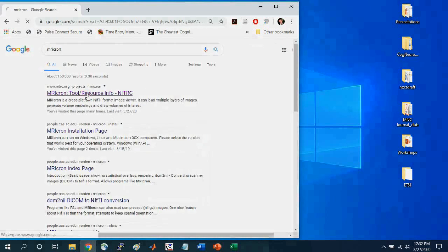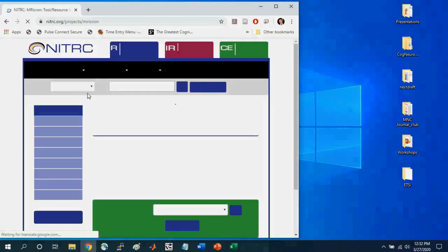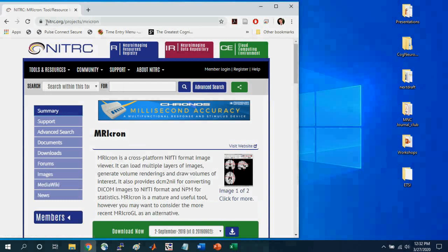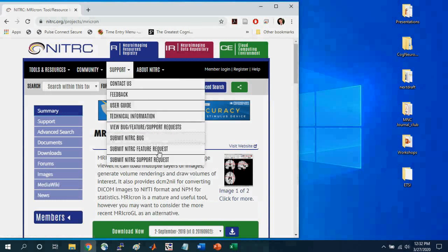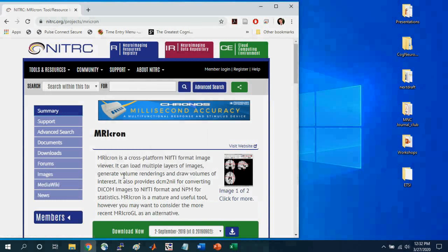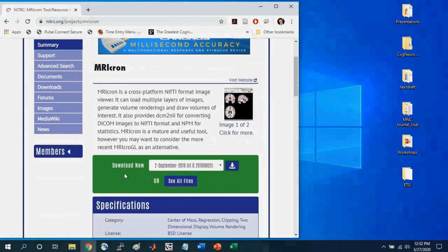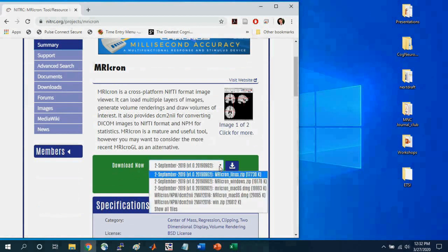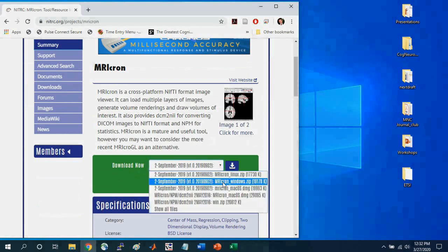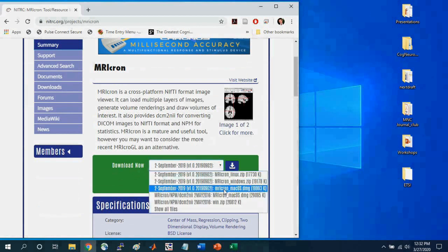Go to this website here, and you can go to the Download Now drop-down menu, and choose the version that works for your computer.